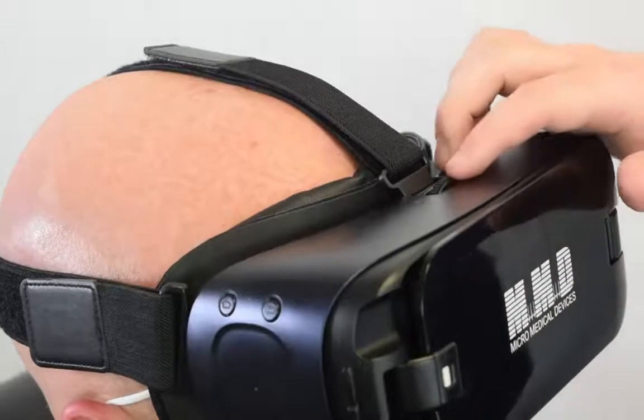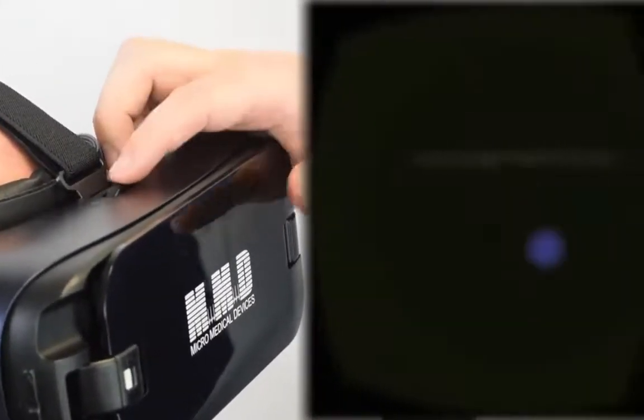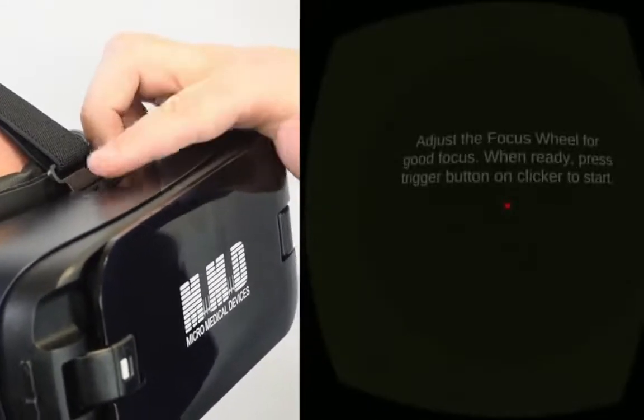Using the VF2000's user-friendly focus wheel, you can change the magnification of the device's internal optics, eliminating the need for eyeglasses or trial lenses while operating it.